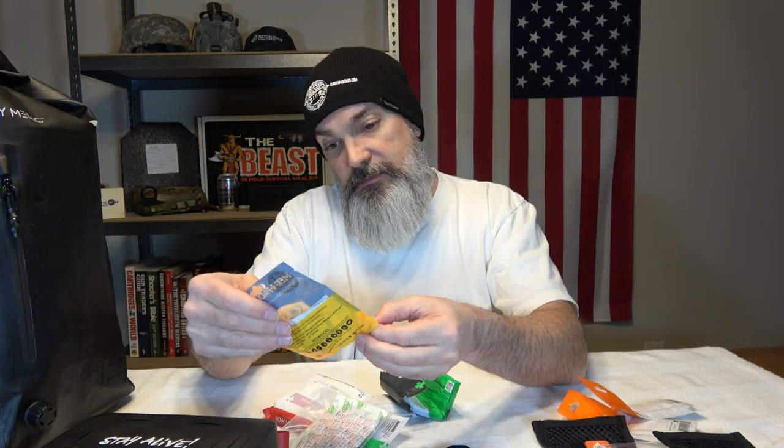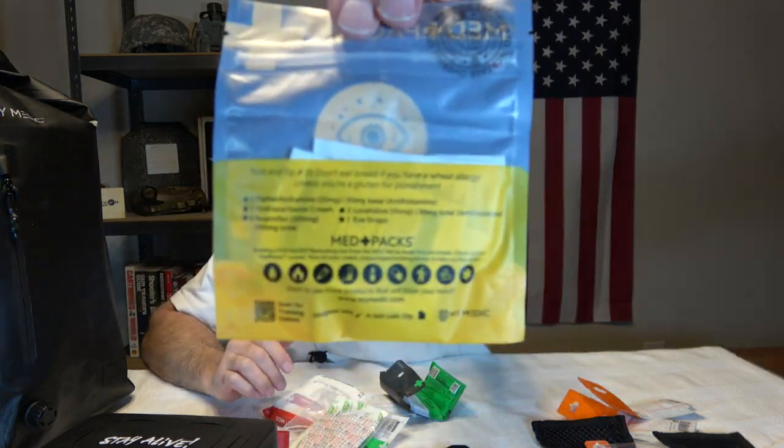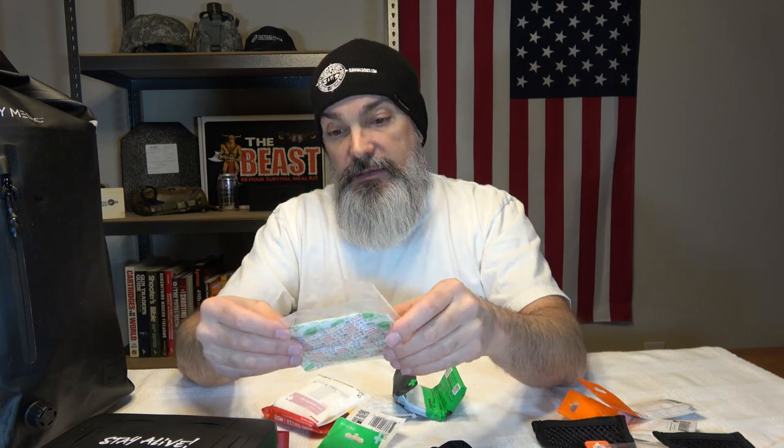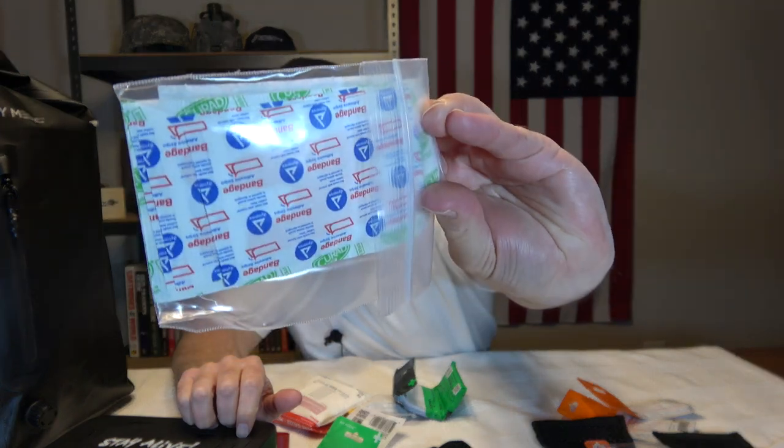There's a lot of stuff in this one. We've got some medications — some for allergies. We've got some tablets, some hydrocortisone cream, some ibuprofen, some antihistamines, more antihistamines, and some eye drops. All kinds of stuff. And again, tear notches and Ziploc. Then we've got a bag of just regular band-aids and a bigger bandage.